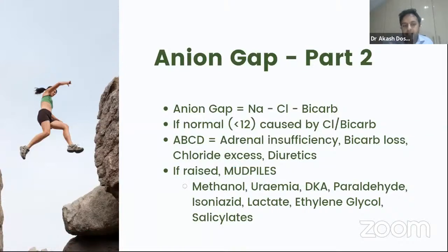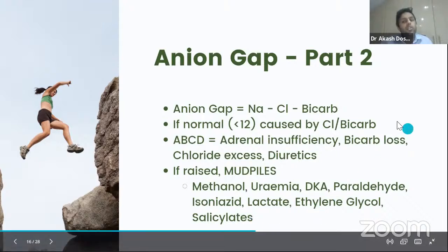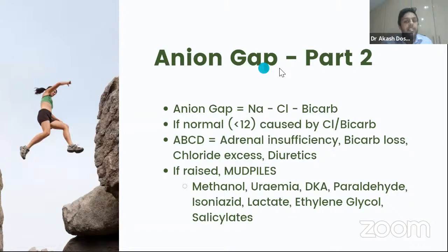Often the newer and fancier blood gas machines will automatically tell you what the anion gap is. Otherwise, you're just going to use MDCalc or something, at which point it's going to tell you it is high or it is low, at which point you just plug it in to causes of high anion gap, and it will give you this list. So ultimately, even if you do think it's going to be clinically useful, in real life what you're going to do is just plug those values into a calculator and it will give you the answer. Knowing this off the top of your head is just not so helpful.